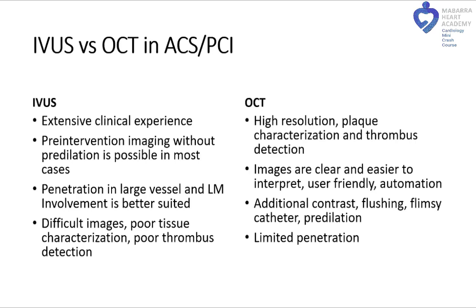The downside of OCT is that it requires additional contrast and may have limited penetration. OCT is not good when you have ostial left main or if you have very large vessels.